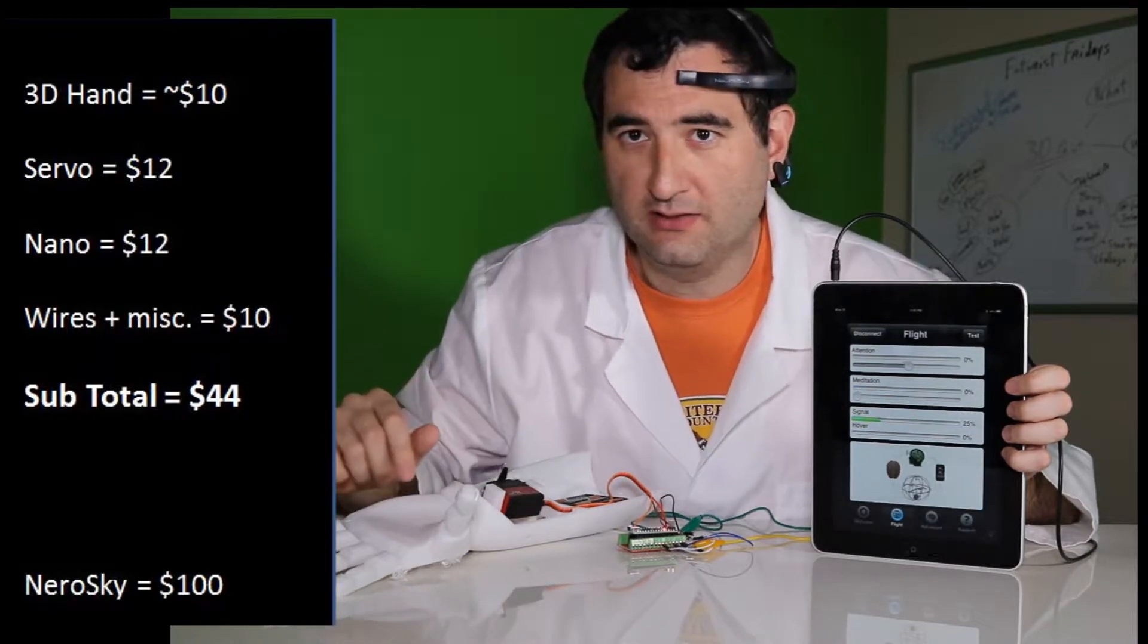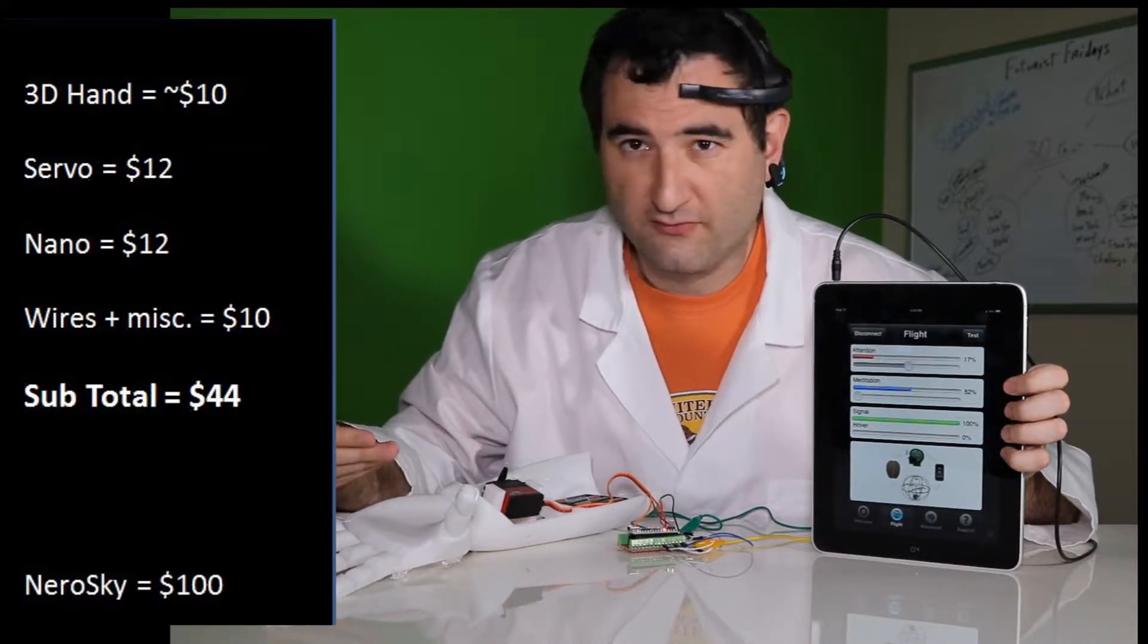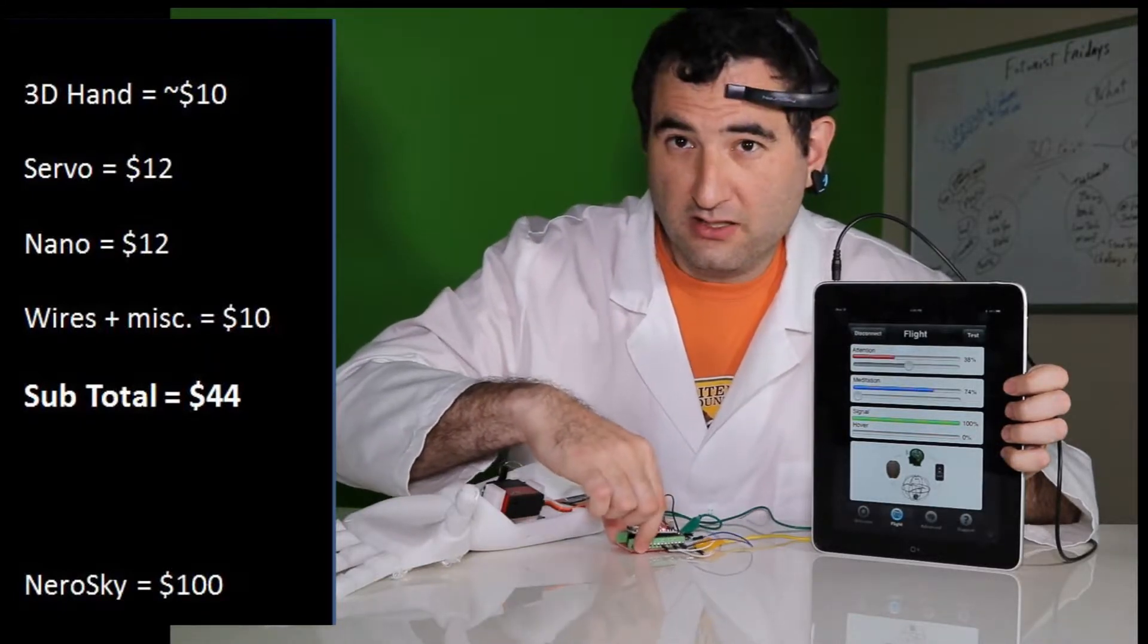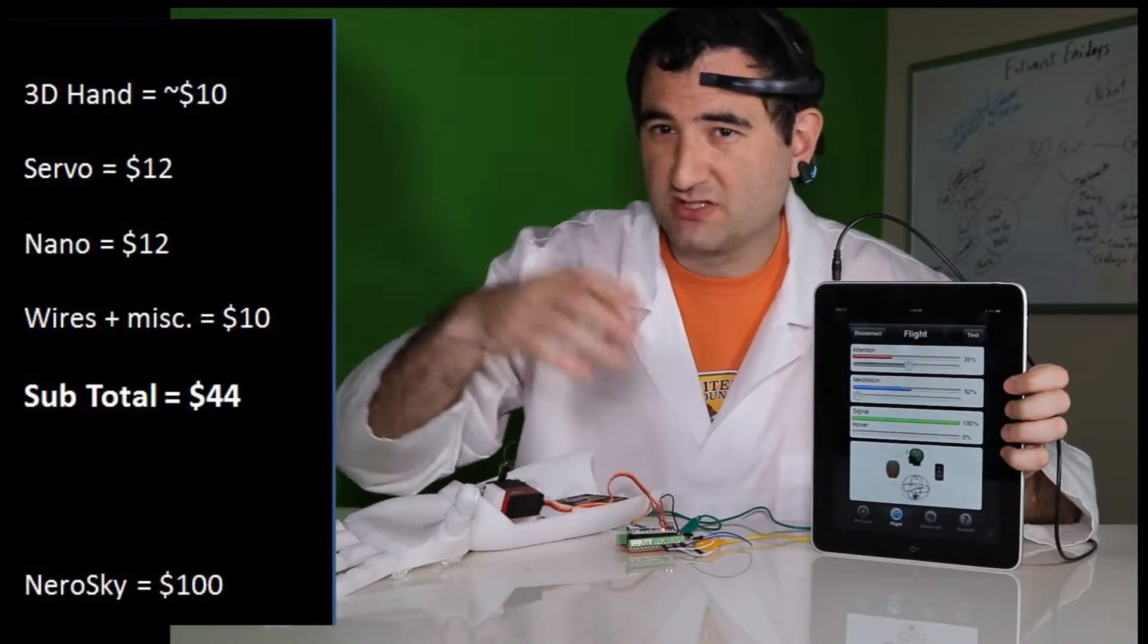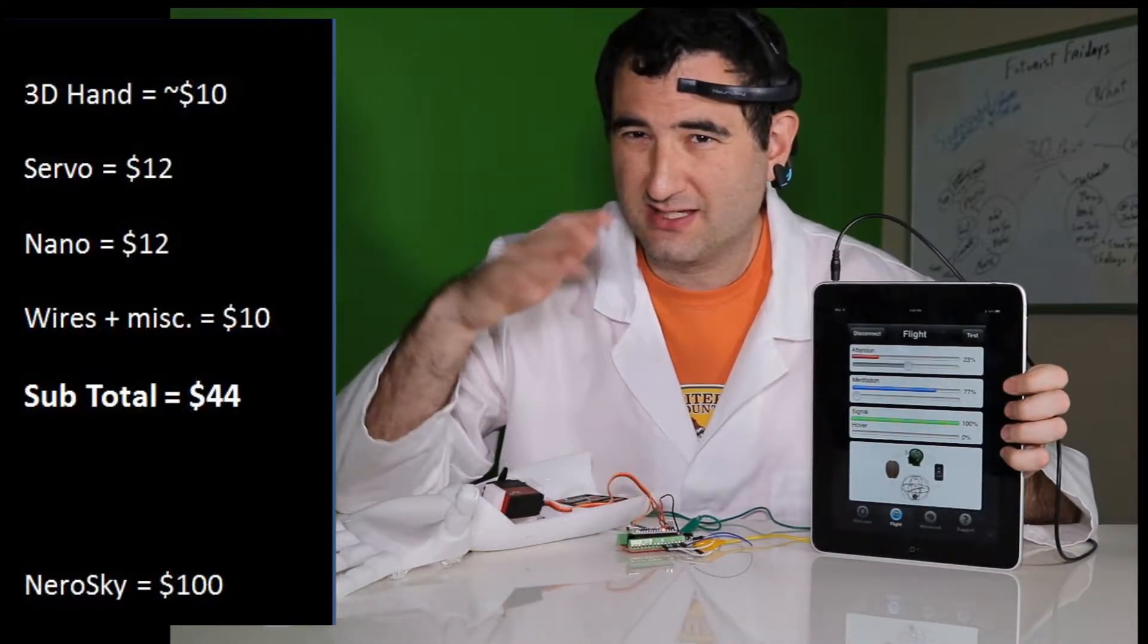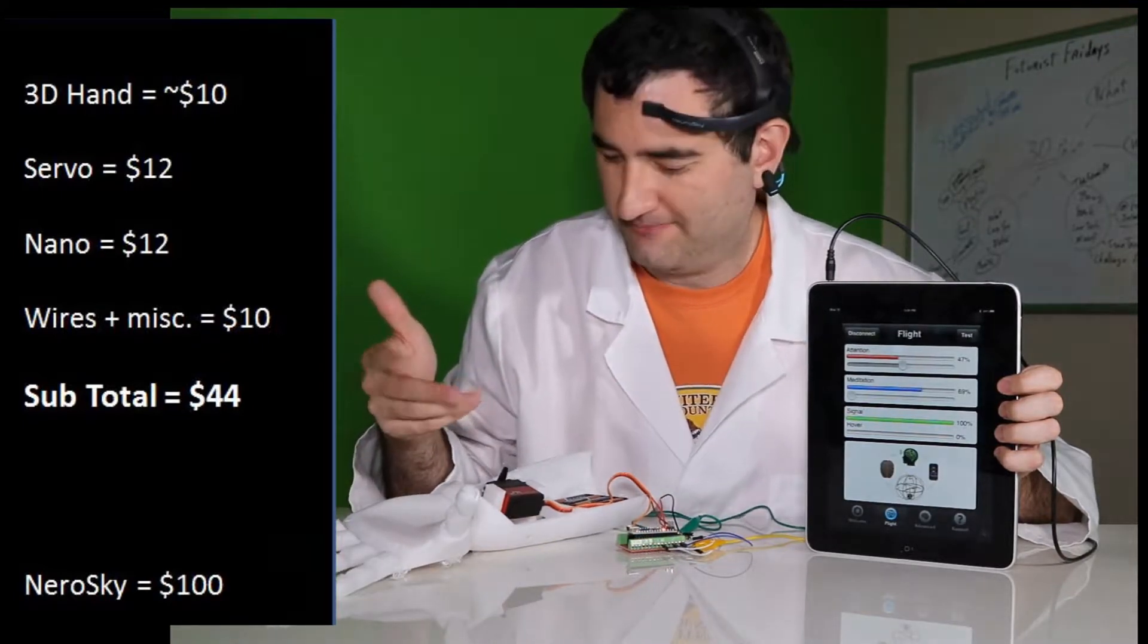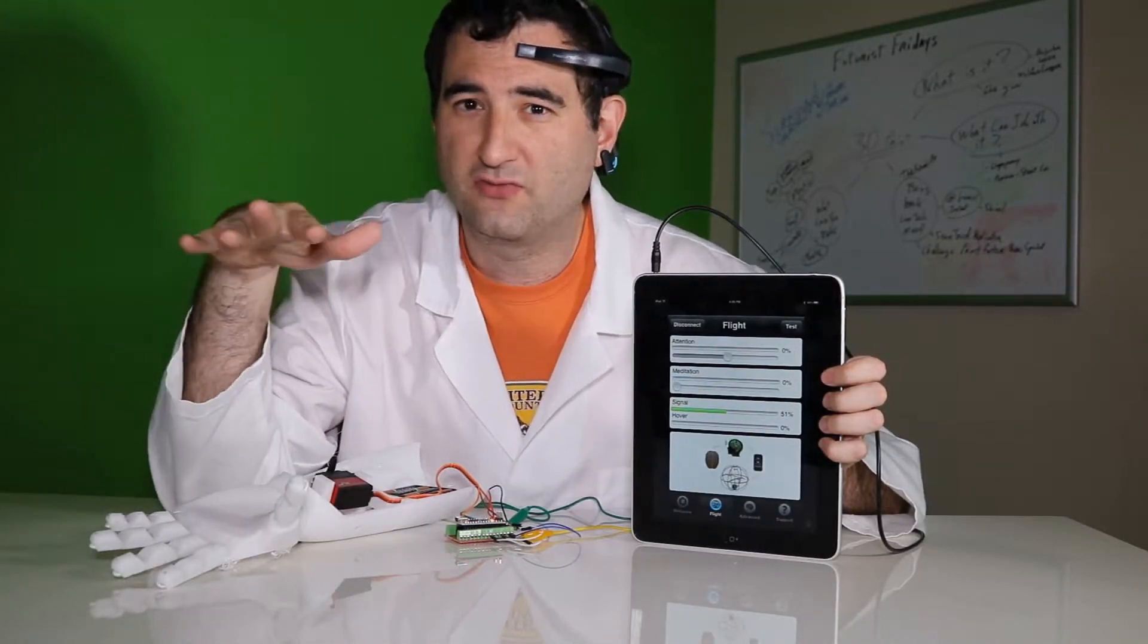This hand is 3D printed. I printed it using PLA plastic, probably a fourth of a spool. So it's around five, but we'll give it an estimate of $10. The servo itself was around 12. The nano and the shield that came with it, I used banggood.com, which is direct from China. And you can get this nano, I think it's around $7 to $12. The miscellaneous cords and screws is probably another maybe $4, $10.